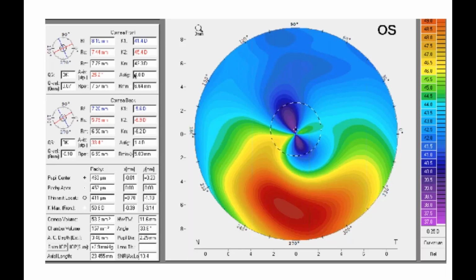So really what we want to do is understand the impact of the cornea, because that's the main refractive surface that we have to interact with our intraocular lens. And I'm assuming that the retina is normal in these cases. Of course, I'm going to double check it. But for the purposes of this talk, we're going to assume there was no pathology in the retina, like a weird staphyloma, which could cause some unusual things. Those things are pretty unusual. So primarily, we're looking at corneal aberrations when we're looking at refractive cataract surgery.